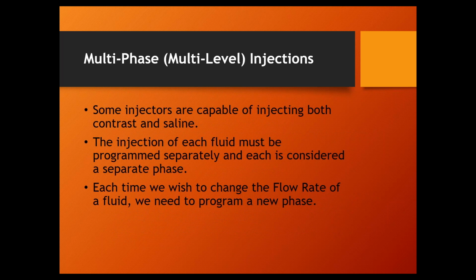Multi-phase or multi-level injections. Now for CT injectors like this one, you notice there are 2 syringes. The green side here is semi-universal. Not everybody abides by these colors, but most do. The green side is contrast, and the blue is saline. Blue is water, so just saline. Some manufacturers stray from those color codes, but for the most part, they stick with that.